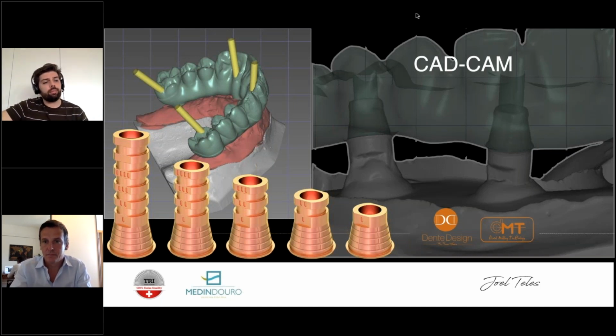Look, the relations with your technicians need to be what I try to say is this: in the past it happened to me, if one of these monolithics breaks at one point, whose fault is this? You're going to blame it on the lab, and the lab will blame it on you. So which of the parts did something wrong? Was a criteria for monolithic construction not done properly, the cooling time, anything that might happen, or is it something that we did?